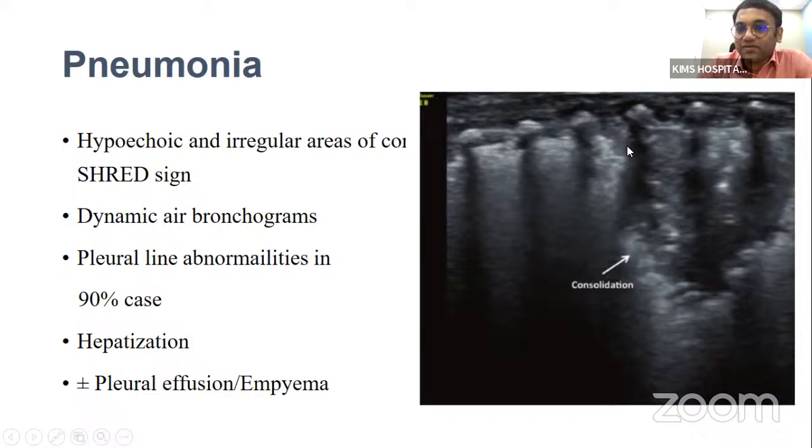If we only find subpleural consolidation with pleural thickening and some B lines, then we can think of RDS, and if the baby is not responding, we can give a second surfactant. But if you find the other kind of picture, then the baby has pneumonia, and rather than giving another surfactant, we need to give adequate antibiotic coverage for the baby, and then the baby will improve.